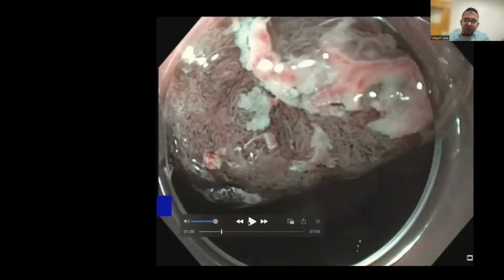So then I took a closer look. Now, this scope didn't have near focus. It's just an H190 scope. So I want to show you that even with basic scopes, you can get decent imaging. So this is without near focus. And what you can see is that it's not so easy to appreciate, but this whole area essentially is demarcated.